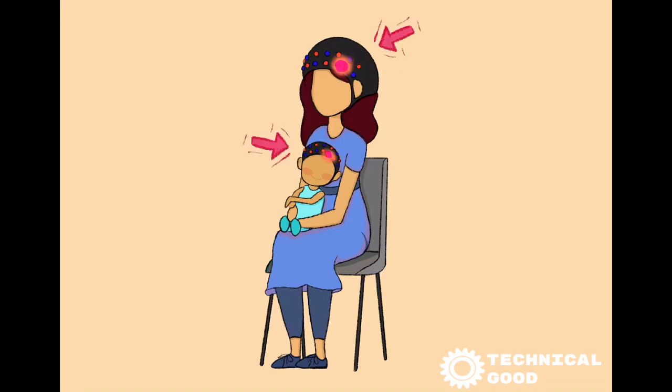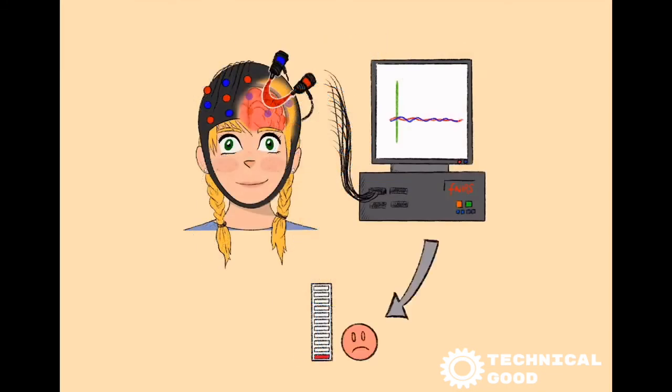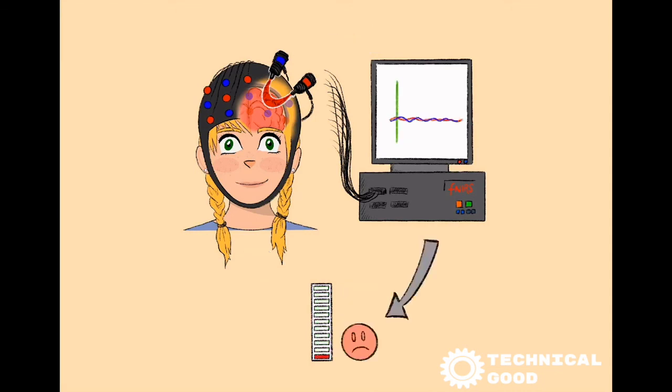Isn't that cool? Children who are facing difficulties, for example with hearing or attention, can also take part in a fNIRS experiment. Brain researchers are interested in understanding how and why their brains react differently in certain situations, so that they eventually know how to help these children. fNIRS might even help us to train the brains of these children to help them improve. Brain researchers can show you your brain activity live on a computer screen. You then can try to activate your brain a little more with your thoughts and imagination.